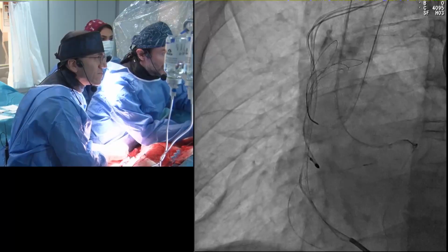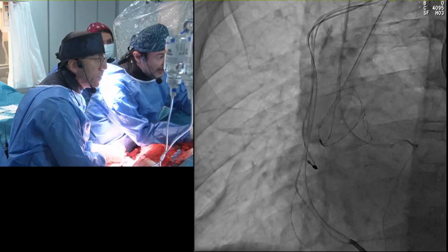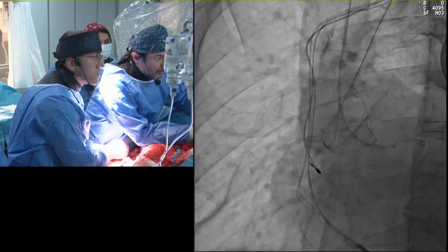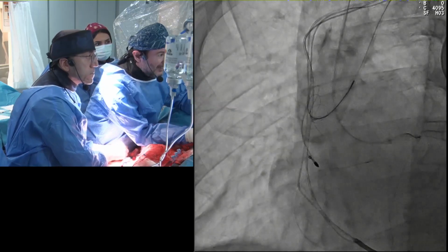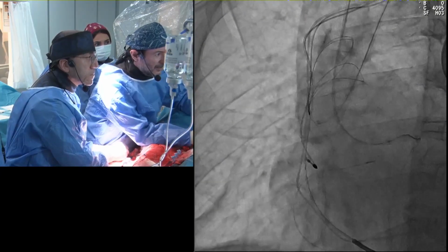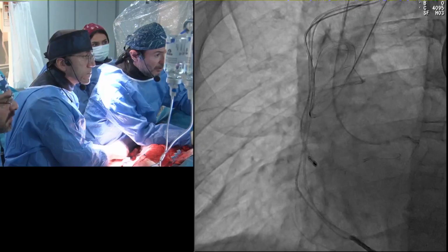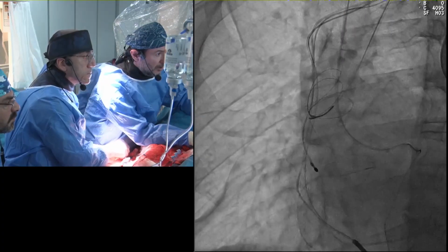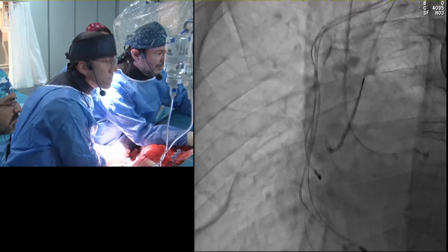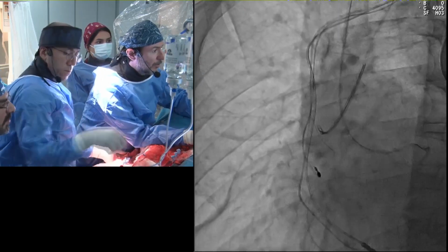Okay, try now pulling the wire and advance it again. Pull it back fully. Now send it. The tip of the microcatheter is too fixed. It's not moving with the blood, because there is a wire in it. The wire is fixed. Pull back, Şeref. Now send it. He injected in it. It didn't catch. It didn't work. It's loose.